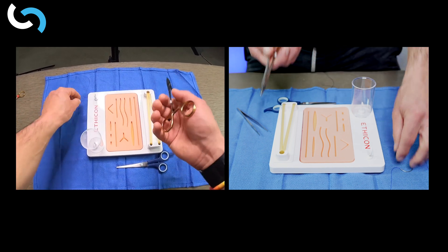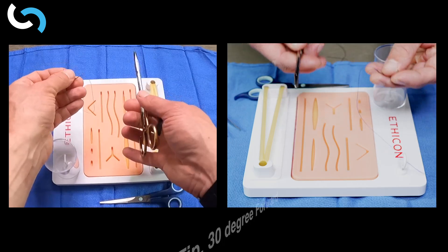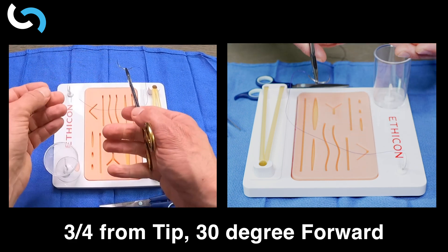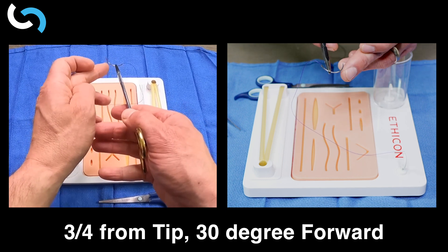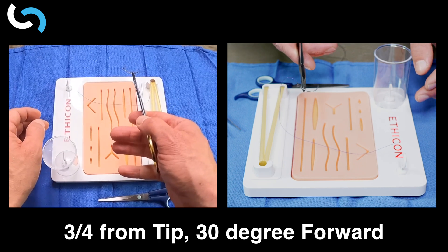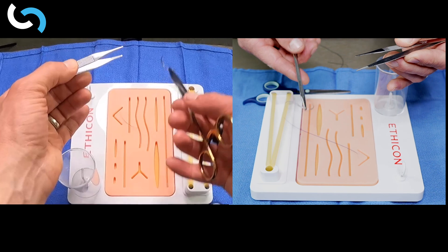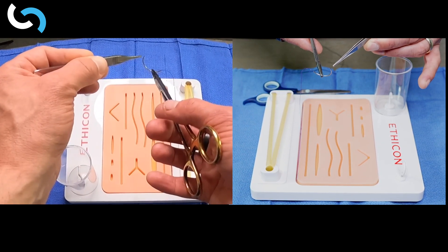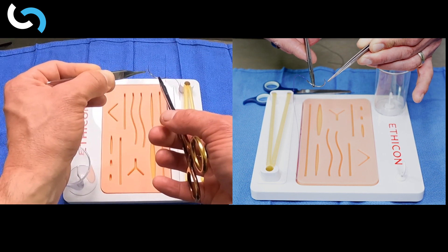When we get our needle driver and needle, the first thing is loading it correctly. We want to be about three-quarters back from the tip with about a 30-degree forward angle. That is going to give us the best opportunity to enter directly into the tissue. Once we have our needle, forceps, and needle driver ready, we can begin to suture. The needle is loaded three-quarters of the way back from the tip with a 30-degree forward angle.